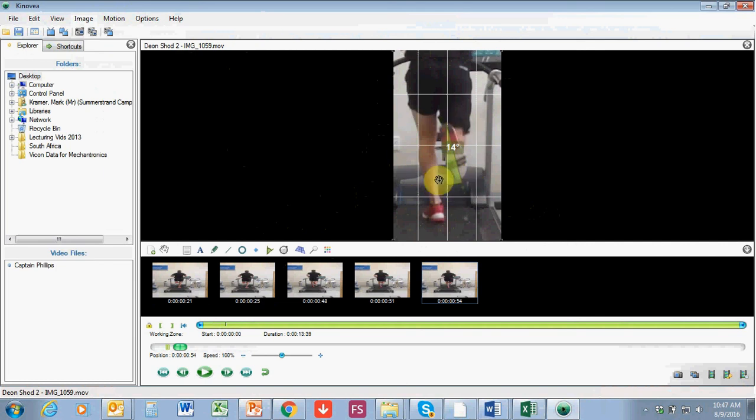Like I was saying, normal you're looking at about 5 to maximally 8 to 10, not more than that. So here's quite a bit of medial heel whip. Again, I would screen capture this and use it in my reports for further analysis. Okay, good. Alright, so then I can delete this again. I will hide the grid.